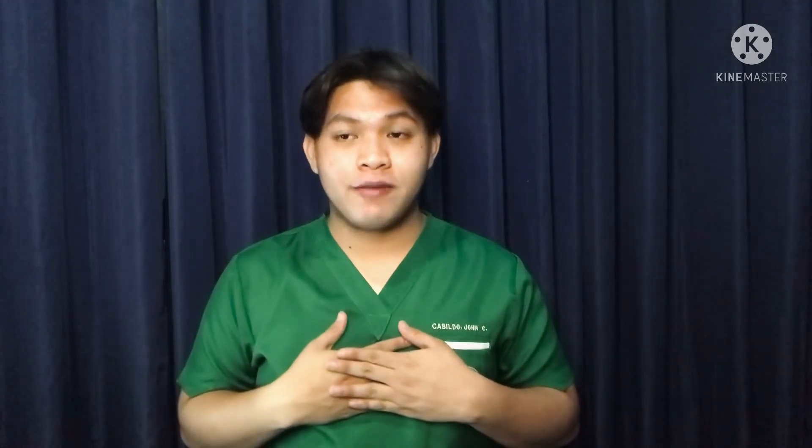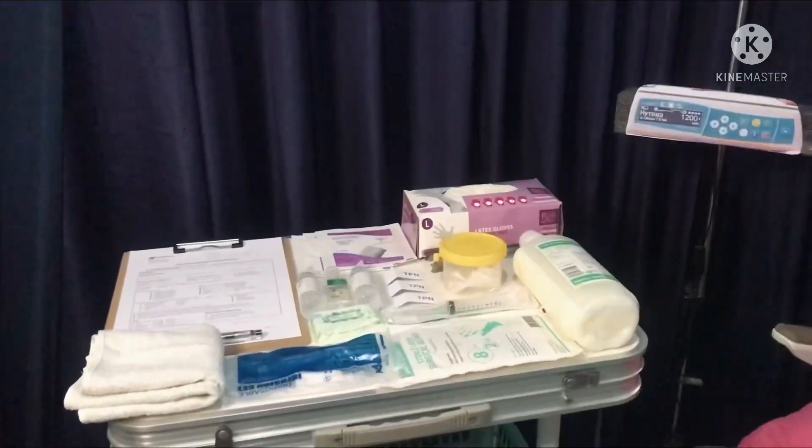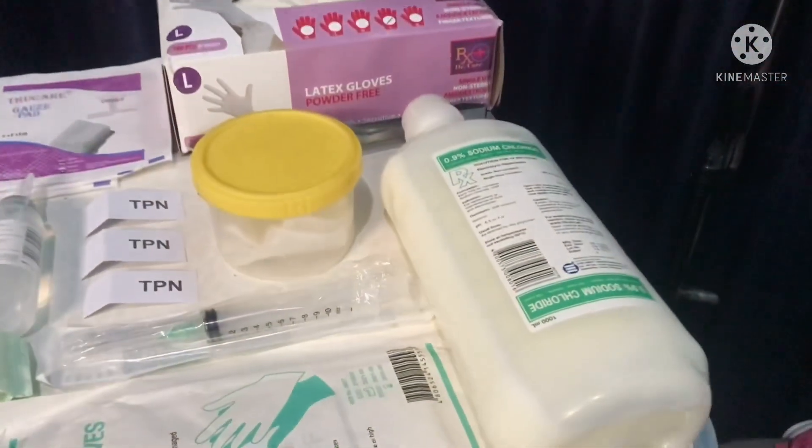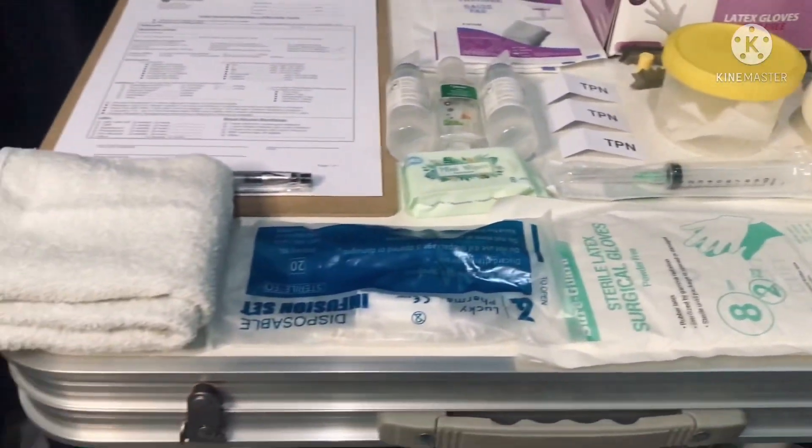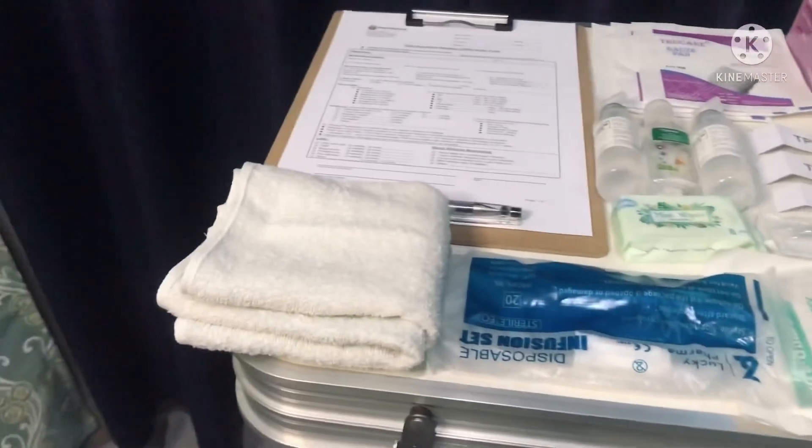Just like everything else, we're going to wash our hands, provide for patient privacy, explain to the client what we are going through, why it is necessary, and how she can participate. Identify yourself and identify the patient using agency protocols or using the two patient identifiers. The key to maintaining a sterile technique is to be well prepared and have all the essential equipment gathered.